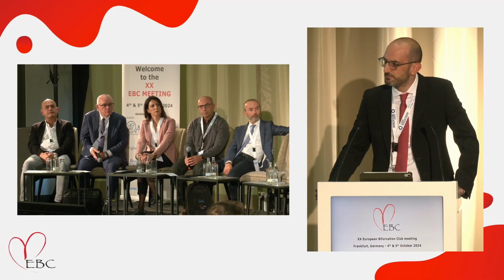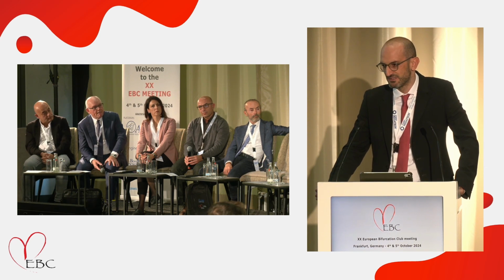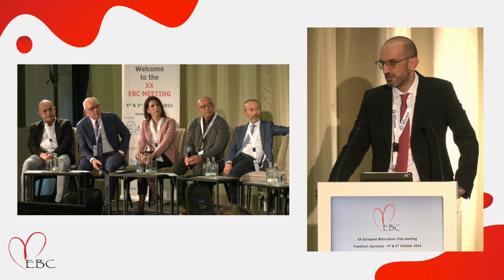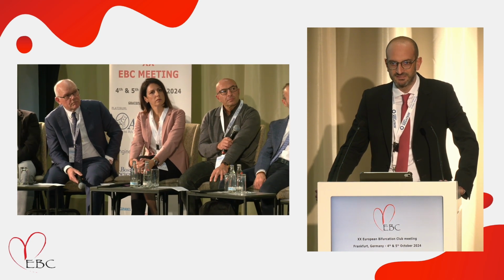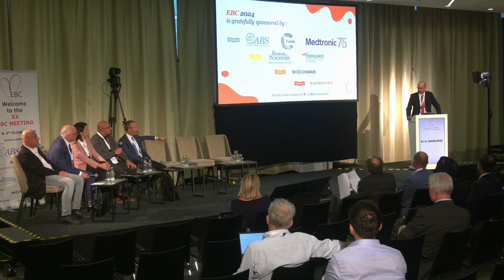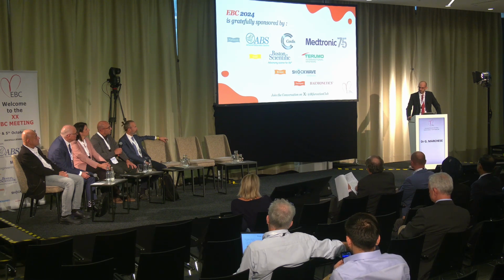No, we just did the final imaging because we thought practically that we didn't have so many other options apart from IVL, because we don't believe in this subset, in this kind of focal lesion, especially. I'm not an expert in OCT, but this sounds like a calcific nodule protruding into at least the circumflex, and we don't believe that the rotablator is the way to treat this kind of lesion.